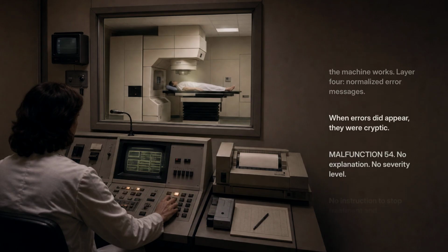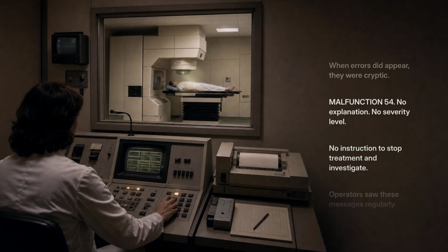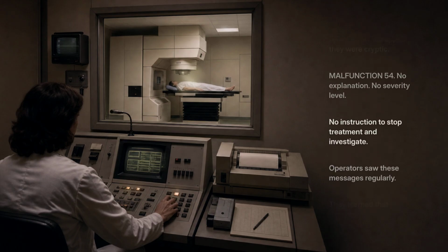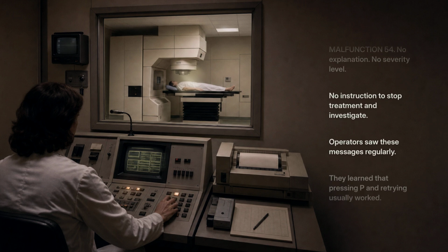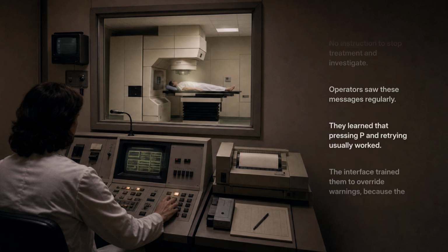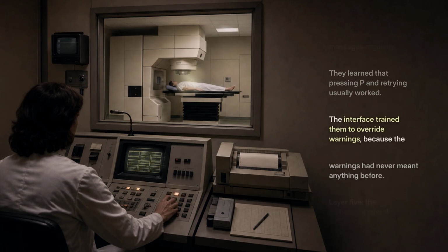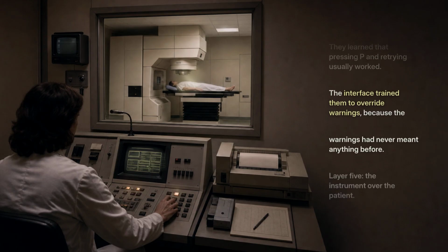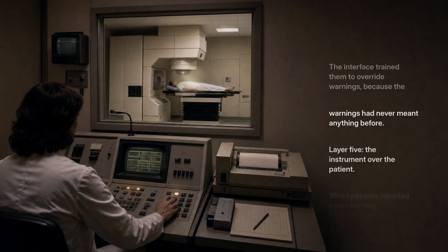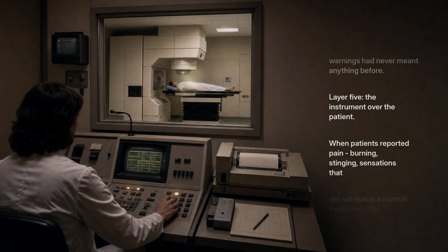Layer 4. Normalized error messages. When errors did appear, they were cryptic. Malfunction 54. No explanation. No severity level. No instruction to stop treatment and investigate. Operators saw these messages regularly. They learned that pressing P and retrying usually worked. The interface trained them to override warnings because the warnings had never meant anything before.